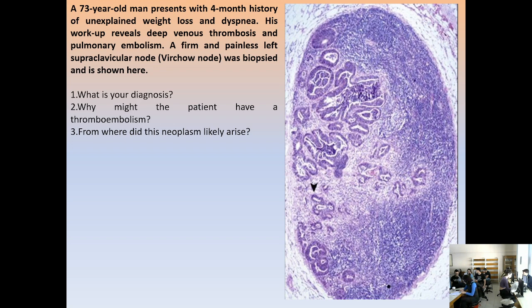This is the abnormal. The tubular structures are a foreign tissue. Yeah. We shouldn't find that in the lymph node. Which is the normal lymph node parenchyme? That one, yes. Why? Because these are lymphocytes, and lymphocytes stain dark blue because they do not have much cytoplasm, so they are blue. Now, this is a foreign tissue forming tubules, tubular structures.